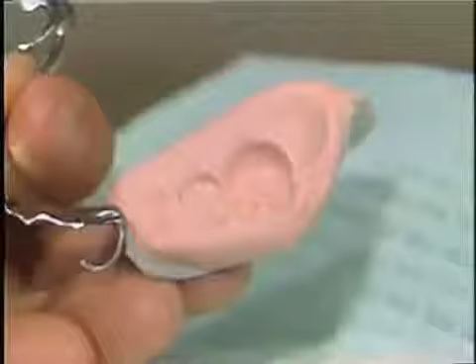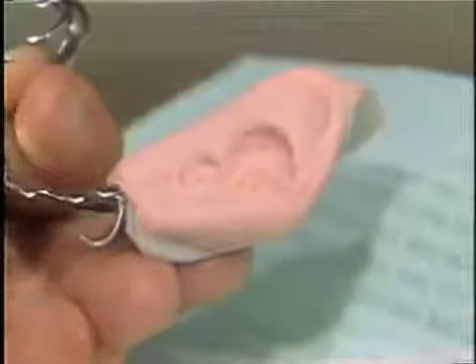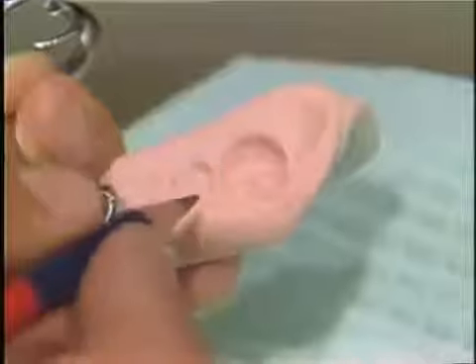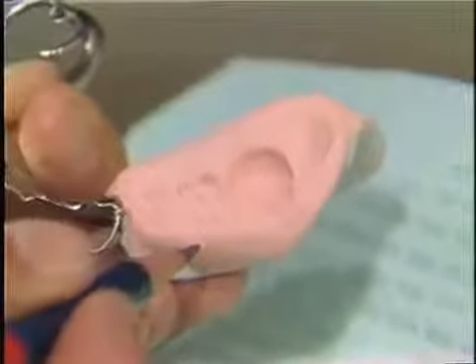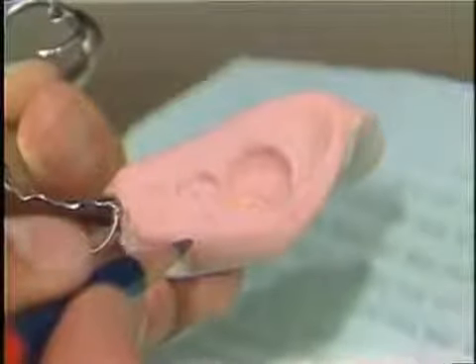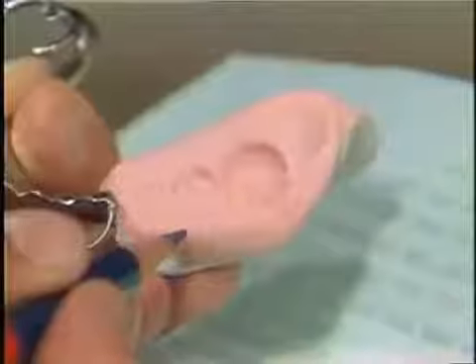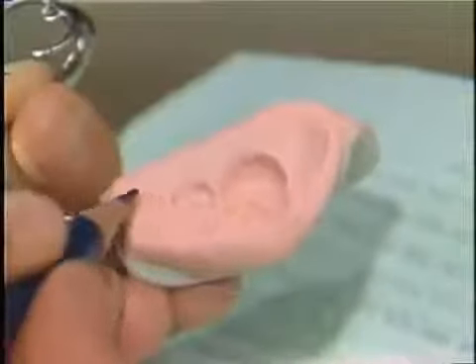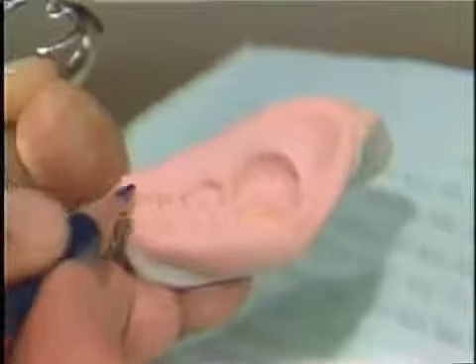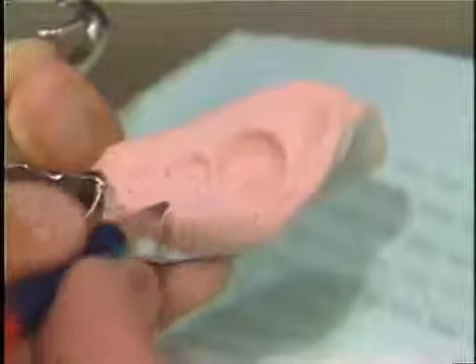So we're going to level the table and take the indentations off and thin it buccolingually so that it is wide enough to have an indentation of the opposing tooth, but will not interfere with the tongue or any of the soft tissue of the patient's mouth, the cheek, etc.